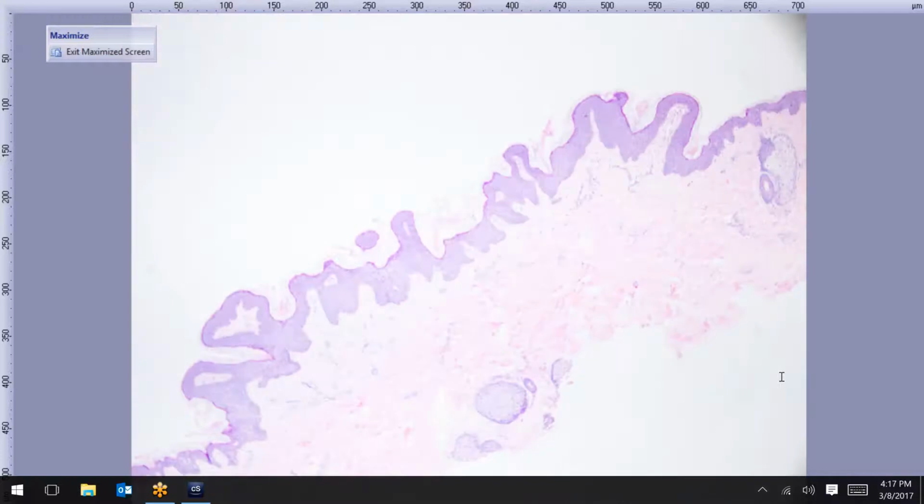Now here's an example I'll often show you. I probably have showed you guys this before. Oh yeah, lower power of the mouth.